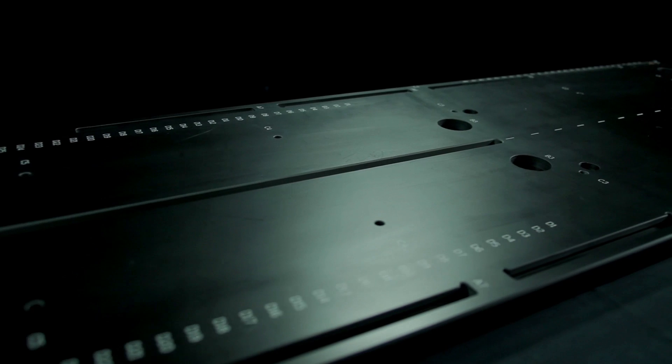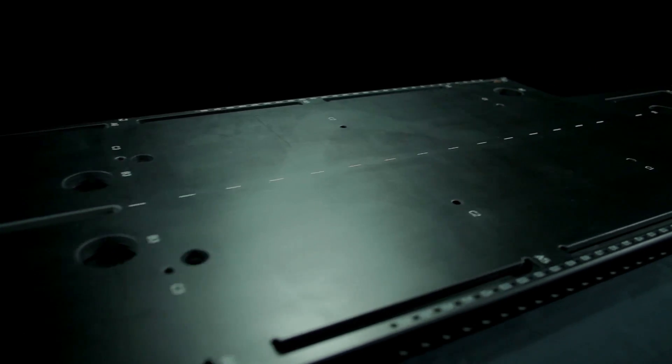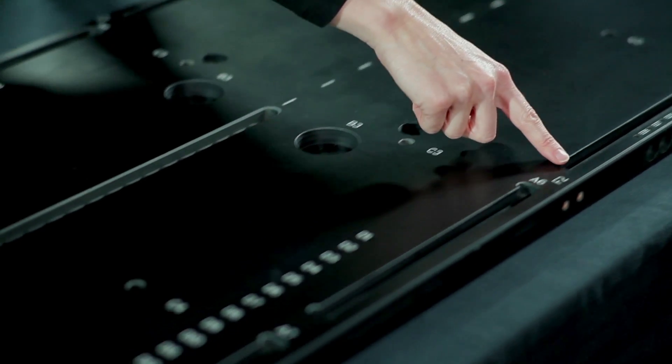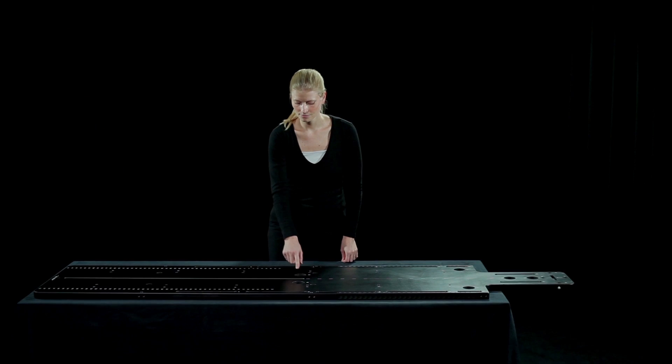The baseplate is made out of glass fibre, which makes it MRI compatible. It has different holes and engravings to index the SBRT accessories in a reproducible way. It also has a number of slots allowing a thermoplastic immobilization mask to be attached.